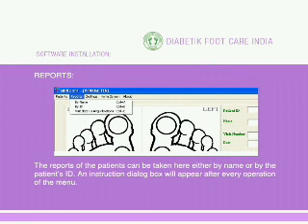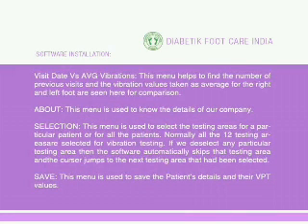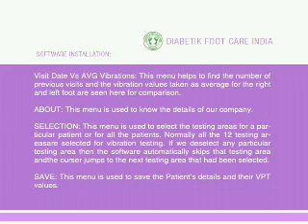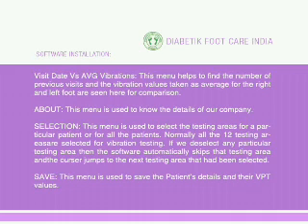Reports: The reports of patients can be accessed here either by name or by patient ID. An instruction dialogue box will appear after every operation. Visit Date vs AVG Vibrations — this menu helps find the number of previous visits and the average vibration values for the right and left foot for comparison. About — this menu is used to know the details of the company.